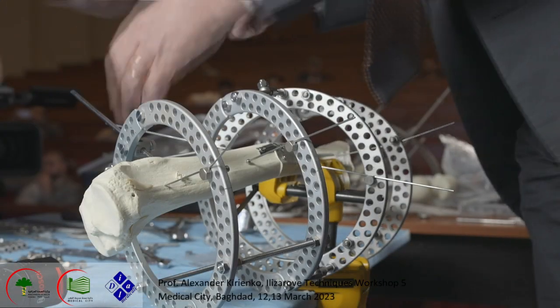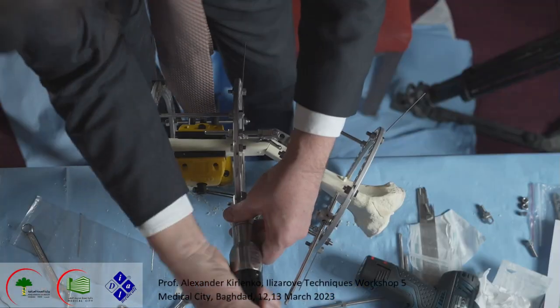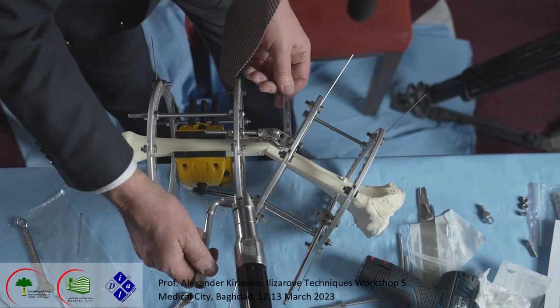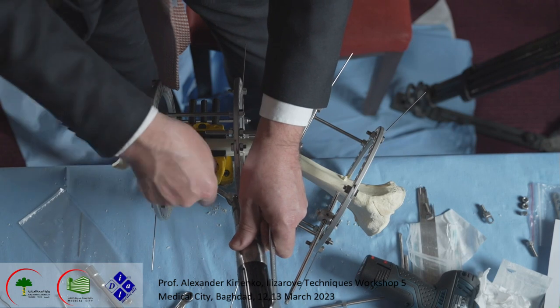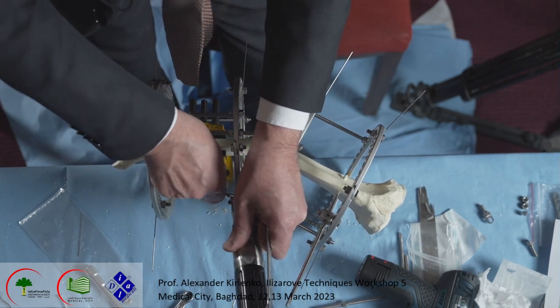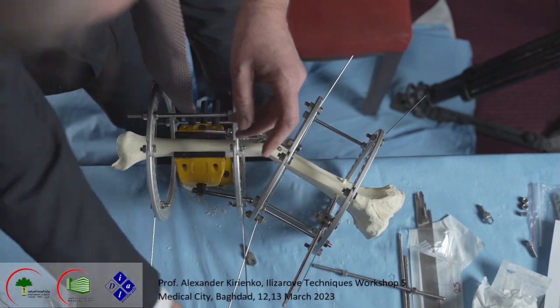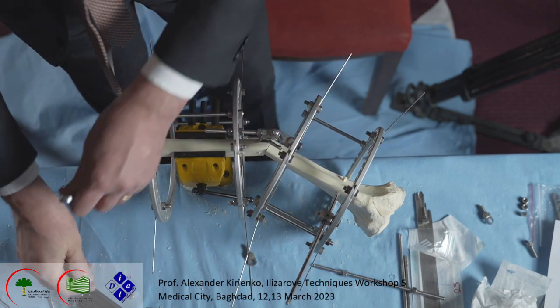Pay attention. Okay, tight. And now I should tighten a little bit more to be sure that it's well done. Okay, perfect.